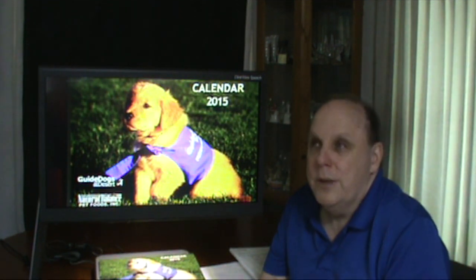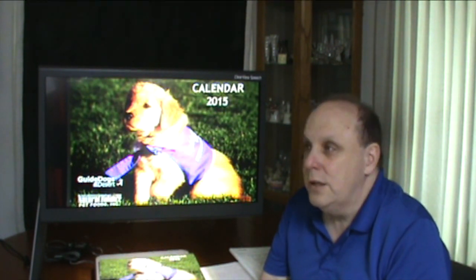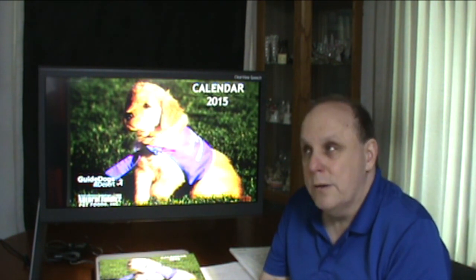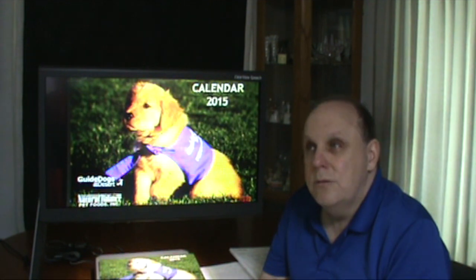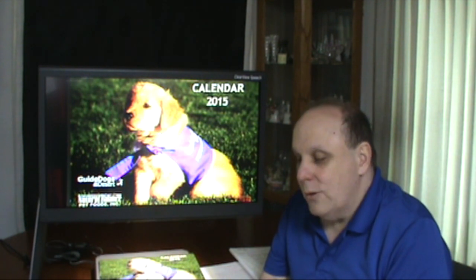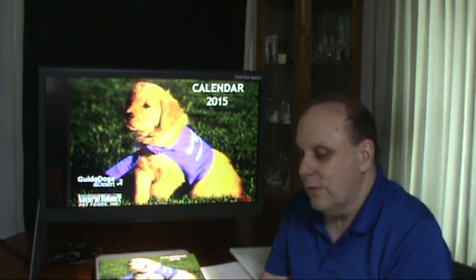Now, the old video magnifiers that used to be on the market many years ago were monochrome. Essentially, they were black and white video magnifiers. Well, today we have wonderful color video magnifiers that will allow us to look at color photos as well as objects, and it will give us the ability to enhance the text to look at text in a bright, vivid modality, if you will. Okay, so we're going to go ahead and show that to you on this edition of Assistive Tech Universe.